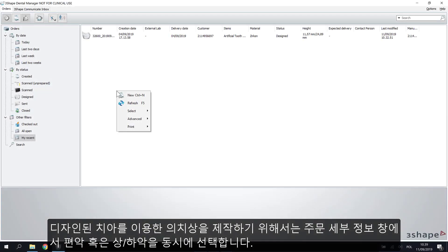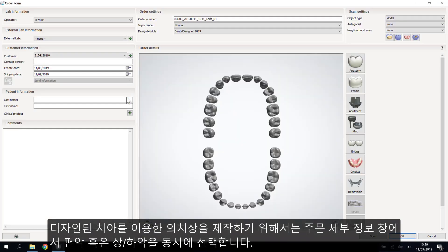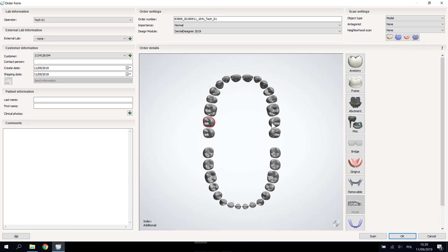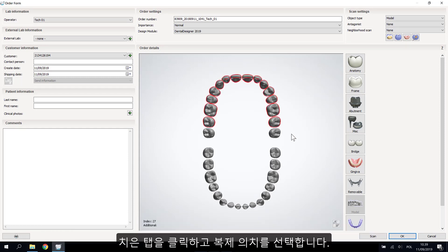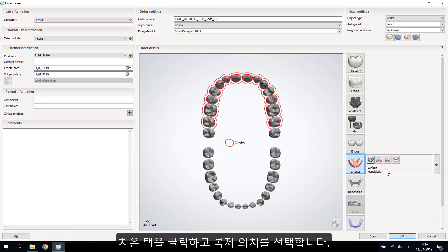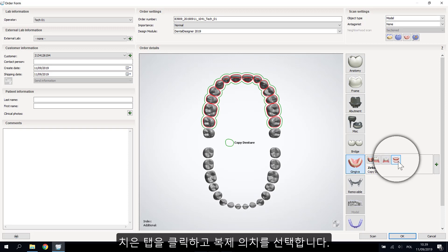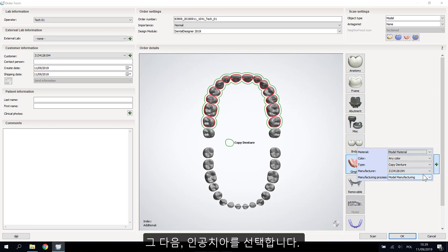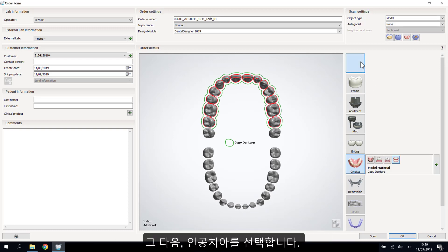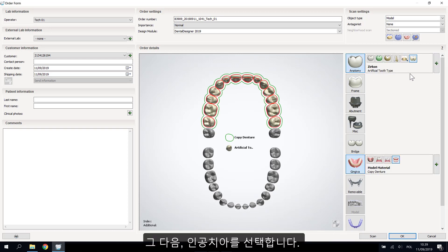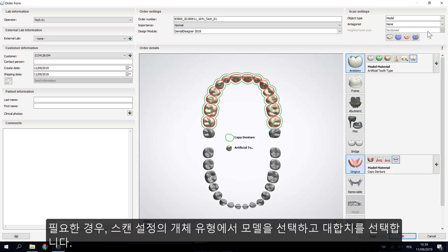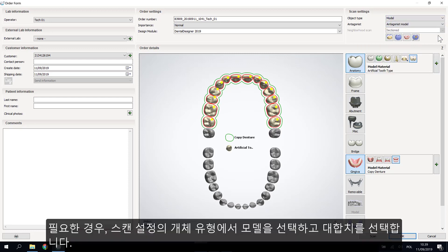When working with Copy Denture with Design Teeth, select one or both jaws in the order details window. After that, click the Gingiva tab and choose the 'Copy Denture' button. Next, select the artificial teeth, then choose the model object in the scan settings and the antagonist if needed.